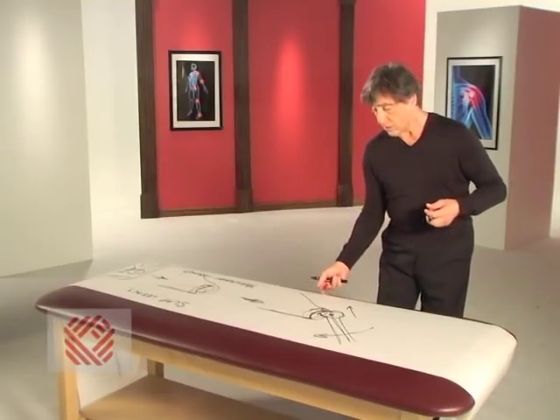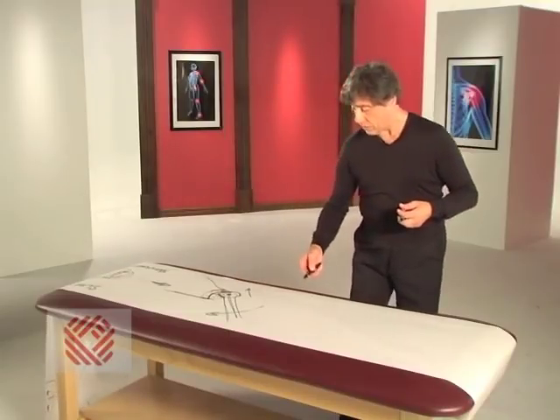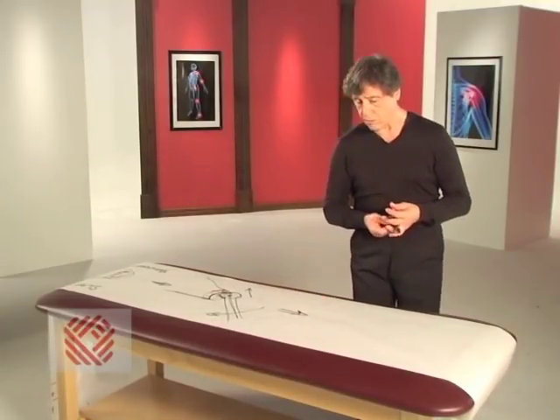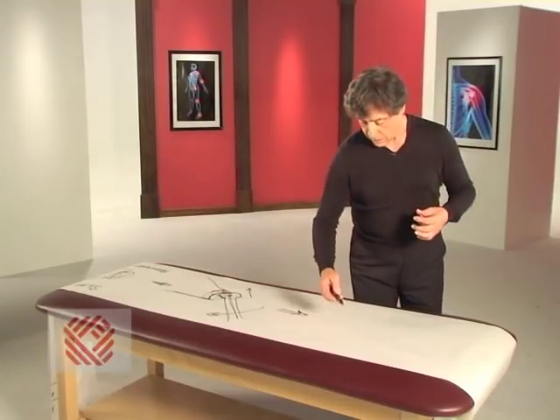Now, let's talk a little bit on how we would repair surgically this Bankart lesion. This is an arthroscopic procedure.